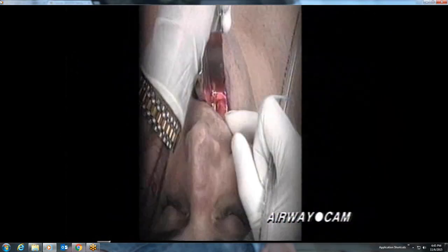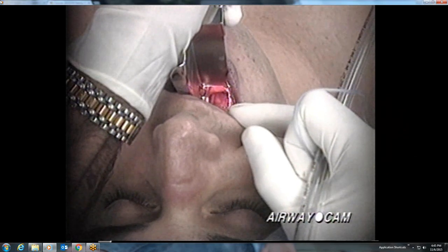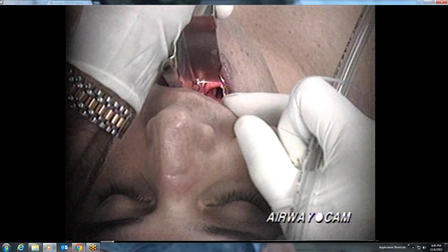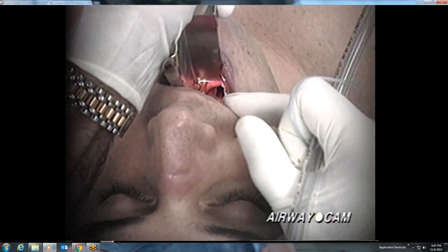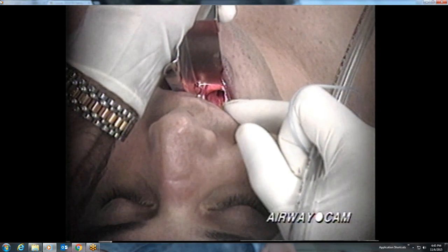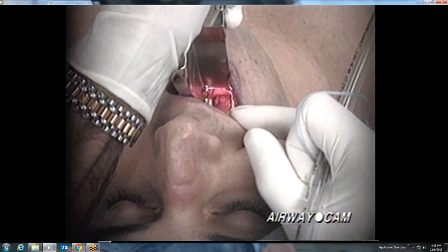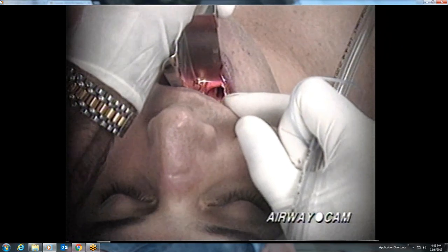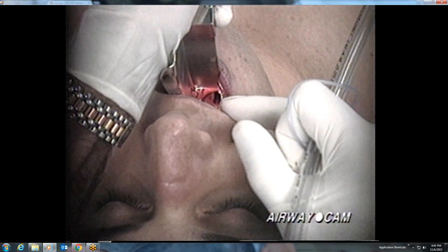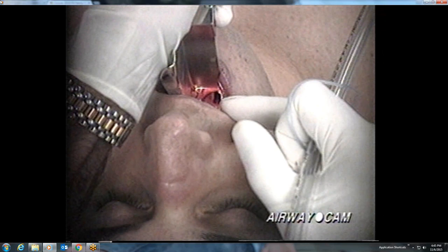In slow motion, the lifting motion with the laryngoscope blade serves to align the laryngeal axis with the pharyngeal axis, bringing the larynx into view. Proper positioning of the patient with 8 to 10 centimeters of head elevation minimizes the amount of head lift that must be done with the laryngoscope blade.